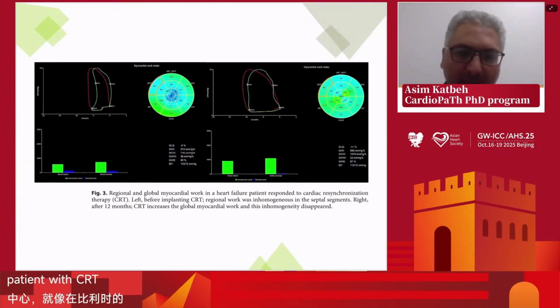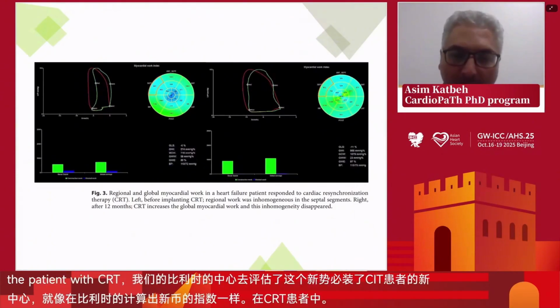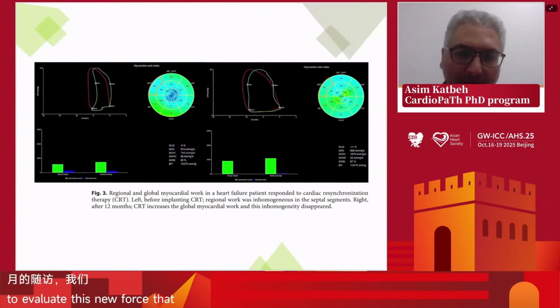and we measured the myocardial work in the patient with CRT at baseline and after 12 months. And as you see here, the CRT increases the global myocardial work, and the inhomogeneity that appeared between the septal segment and the other segments of the heart is reduced.